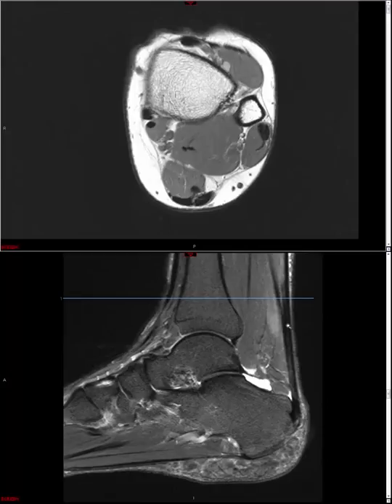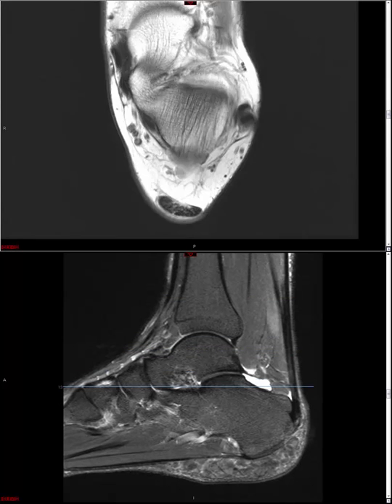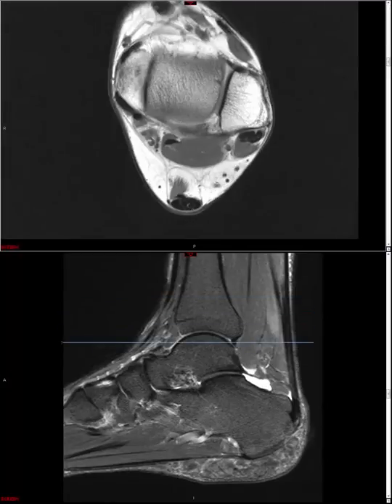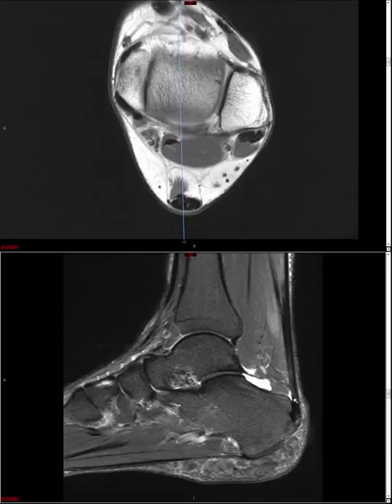It's important to note where the tear is: near the musculotendinous junction, mid-substance, or at the insertion. For a partial tear, it's helpful to give an approximate cross-sectional area of involvement. There's a bursa in the retrocalcaneal region — the retrocalcaneal bursa — and also a superficial or retro-Achilles bursa. In this case there is a drop of fluid, so we might call mild retrocalcaneal bursitis.